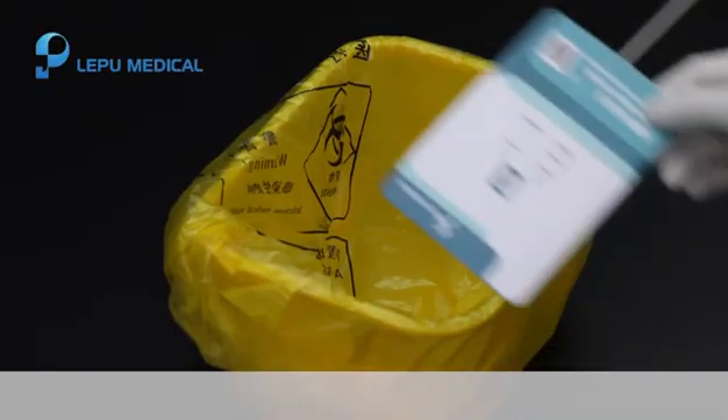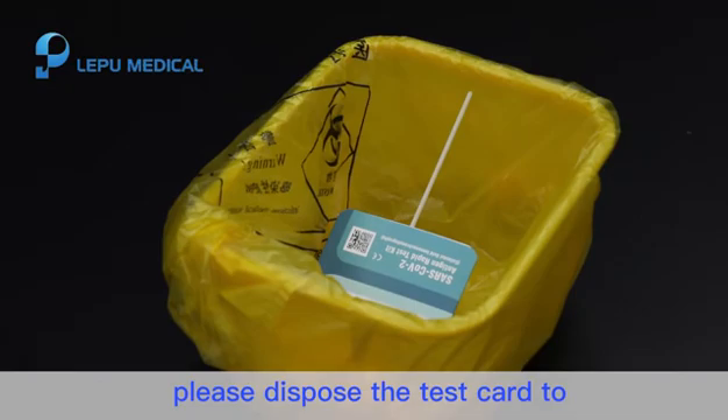Step 8. Dispose of medical waste. After the test, please dispose of the test card in the Medical Waste bin. Thank you.